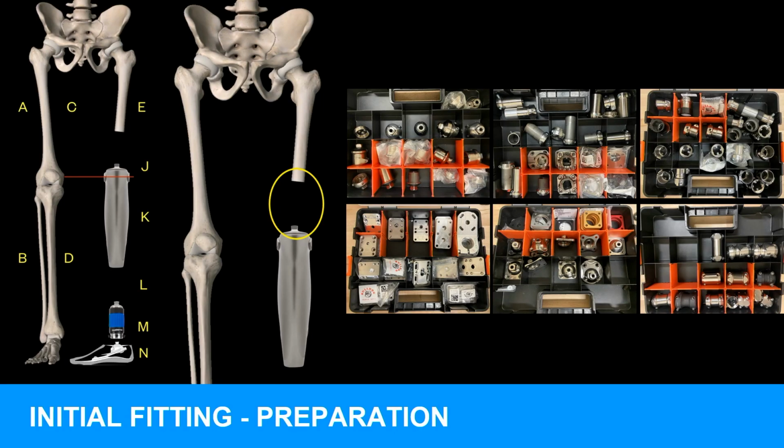That's a small space to deal with. Most surgeons are choosing about 14 to 16 centimeters proximal to the joint space for the amputation level if they have that choice. And that's a small space for us to put an implant, the end of the implant, a connector, offset adapters, and a positional rotator.